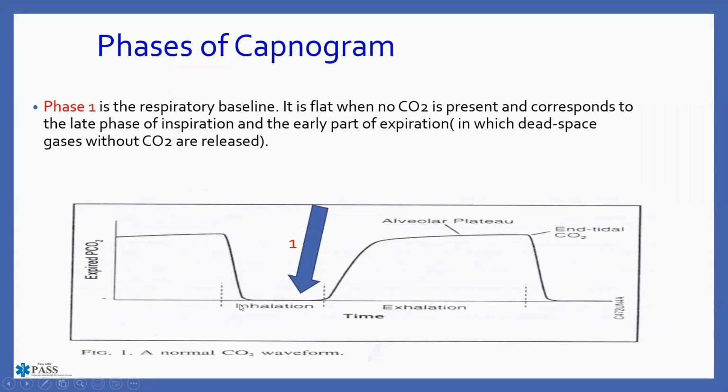The other thing that you can liken it to with an EKG is the bottom line is the isoelectric line if we're talking about EKGs. The bottom line here is the respiratory baseline, meaning basically nothing is taking place at that point. Just like an EKG, there's no electrical activity. The respiratory baseline, there's no inhalation, there's no exhalation. It is just flat. So the respiratory baseline is flat when there is no CO2 present, and it corresponds to the late phase of inspiration and the early part of expiration.